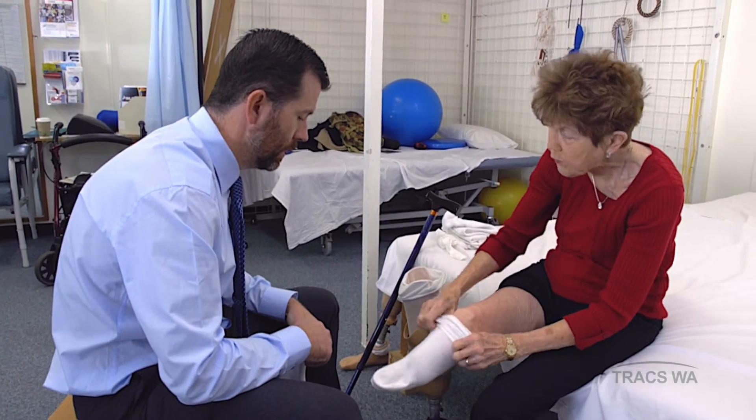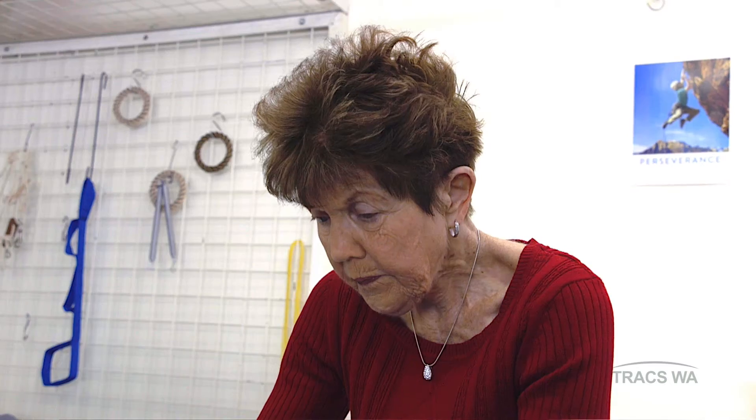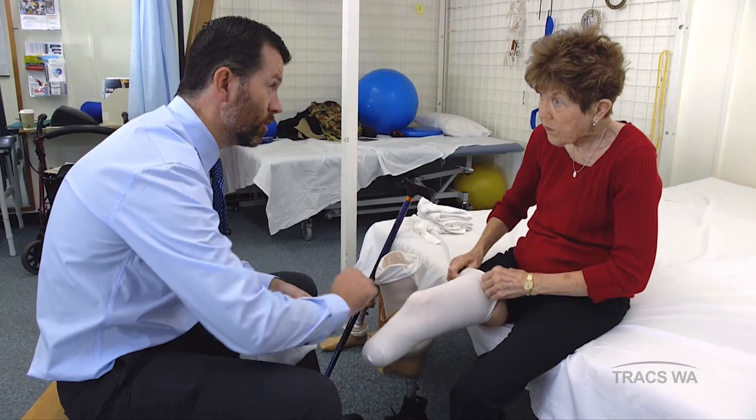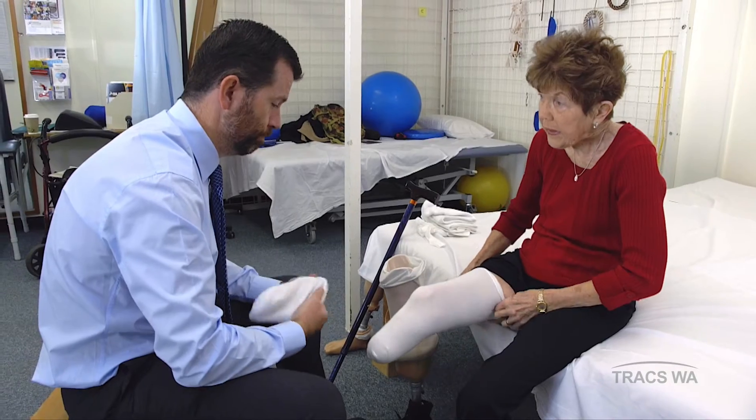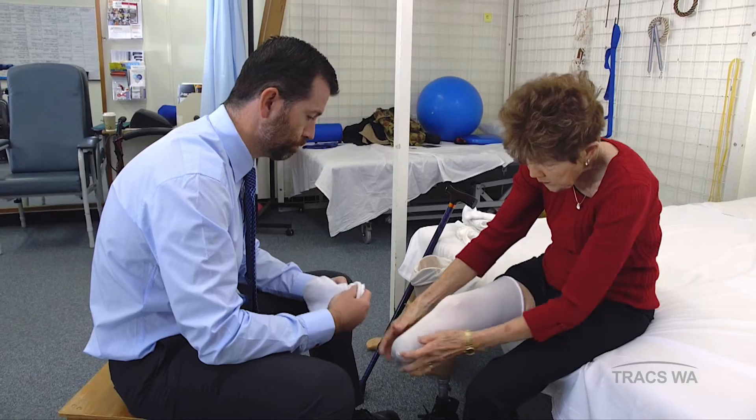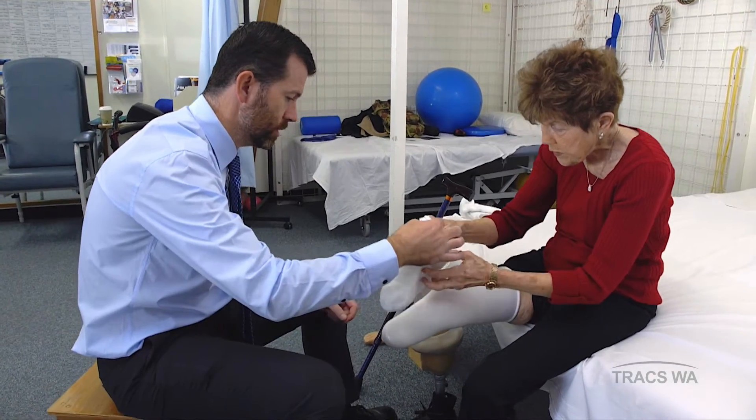Should I always put the thin one on first? It actually doesn't really matter — it's whichever one feels comfortable. Most often the thin cotton socks are the nicest against the skin. It's really important that we have no wrinkles, especially when we've got multiple socks on. I'm putting this one on as well.